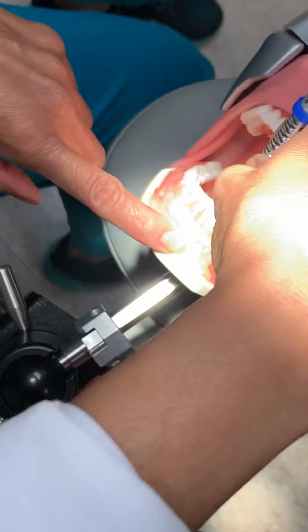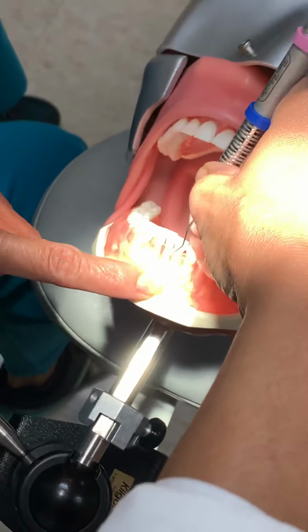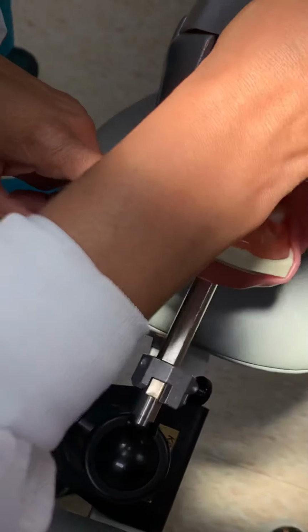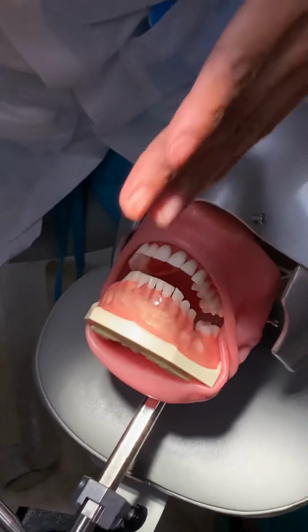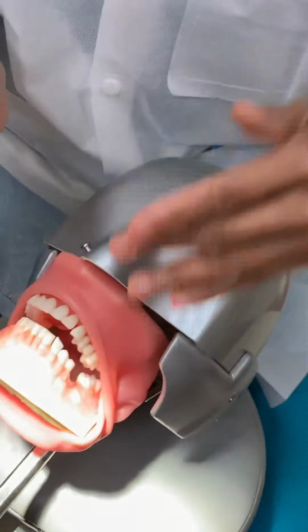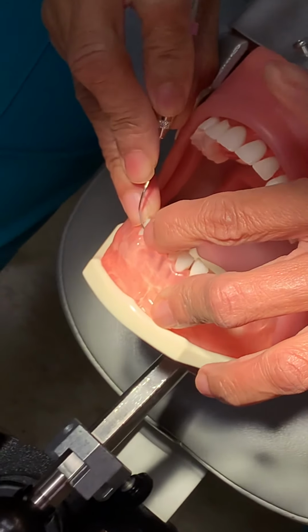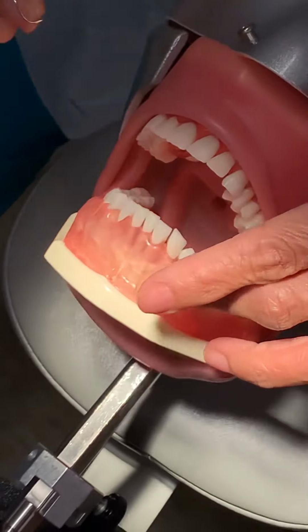So here, get ready zone, coming all the way in approximal. Get ready zone, all the way in approximal. And then the clock position, you go on surfaces away. Here you have your 11 to 1 zone again, okay? So going away, get ready zone, coming in approximal. Terminal shank coming across that tooth when you get on the proximal, okay?